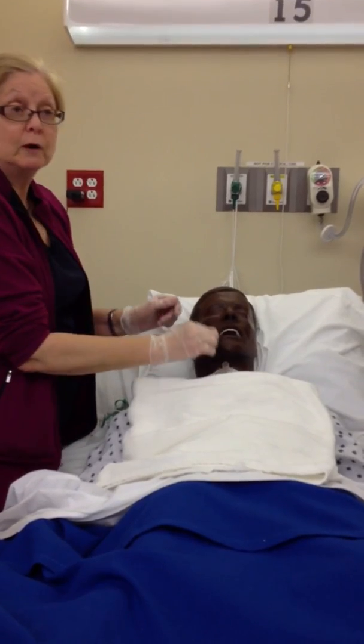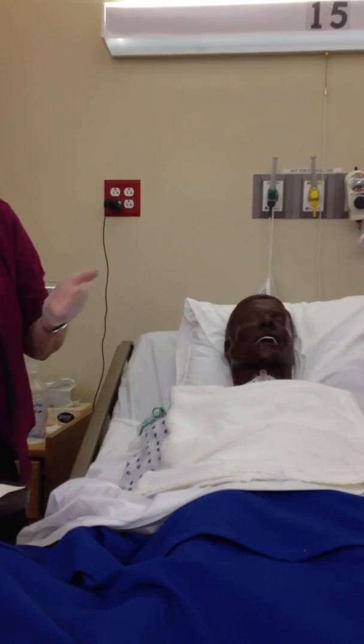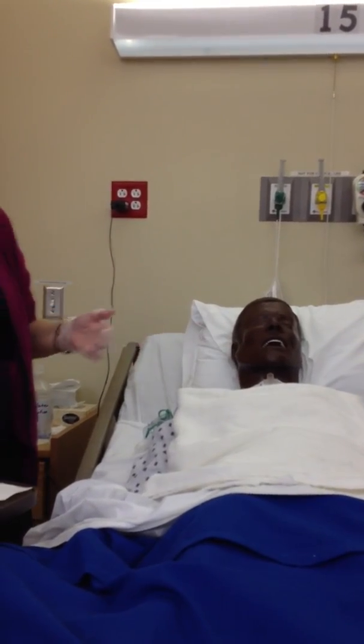Now, once the trach is down, the sterile part is over. We're done. Now we have to clean it though. So now comes the clean part. But once the trach is in, we're good.